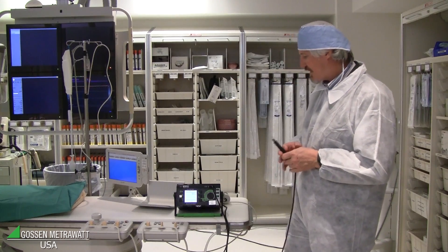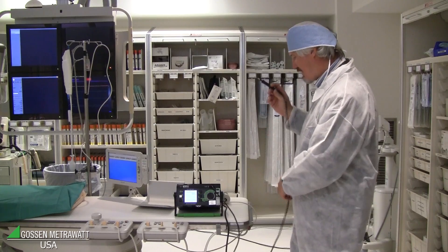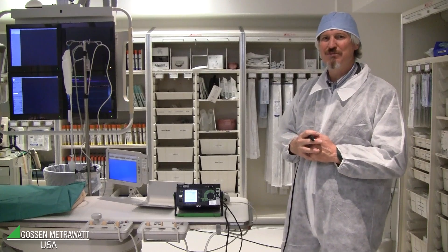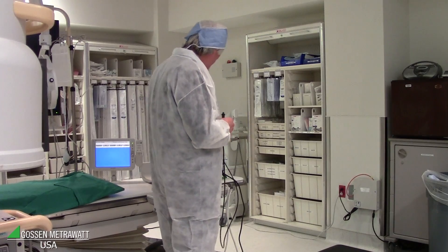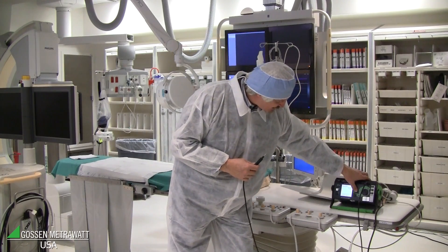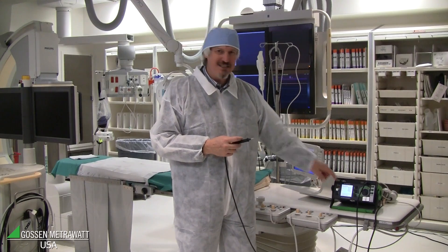We can see touch current is zero or near zero because the probe is not connected. Now I go through all the points which are in the instruction manual of the instrument. It always starts with RMS value, but I would like to see AC and DC. So I push the button to show AC and DC, and I can see both values.